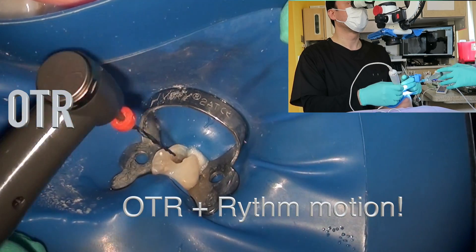Basically, the motor calculates the torque every half rotation, or 180 degrees, and then decides to move forward in rotation or disengage 90 degrees before moving forward. It's really simple. If the torque limit is set very low, this motion almost resembles reciprocation. But if the OTR limit is set at a reasonable setting, you can use it for rotation with the safety of knowing that OTR will kick in and disengage the file if that torque limit is reached. You can think of OTR as smart rotation — you're really using complete 360-degree rotation when possible, and the OTR will kick in and save the day when it's most needed.